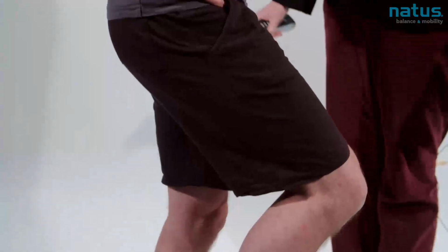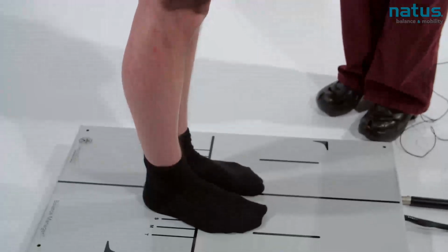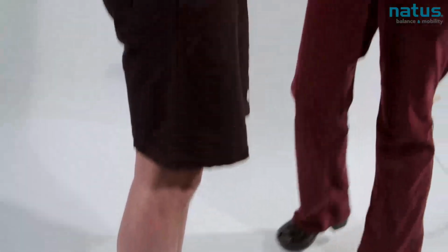And his eyes are closed, and I'm watching to see how he performs. Open your eyes when you feel uncomfortable. Great. For safety, it's very important to let the patient know that if he feels unstable, that he should put his foot down or open his eyes. We don't want him to fall and injure himself during the test. Okay? Are you ready to try the test? Ready. Great. So balance on your left foot.